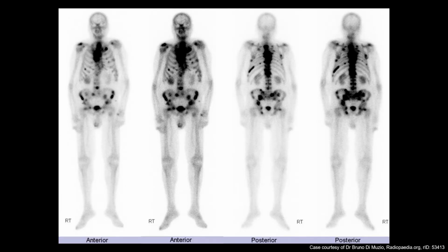So here's an example of that. You can see here there's hotspots all over the place in this individual. Now there's a few places we expect it to be normally hot, so the bladder is commonly expected because as you excrete this from the blood into your bladder out of your body, you'll expect it to collect there. Now there's a couple of other areas where it tends to collect as well, like the kidneys you can see a little bit, but some of these other areas such as up here on the shoulder, within the sternum, and a lot of these spots in the pelvis are indicative of concerning areas. So that could be because of a fracture, because of cancer, because of a number of reasons. Anything that would cause increased blood to the area.